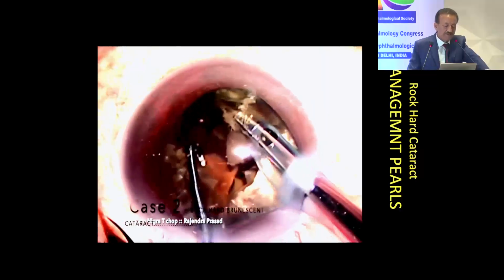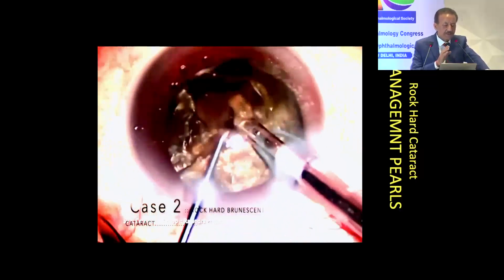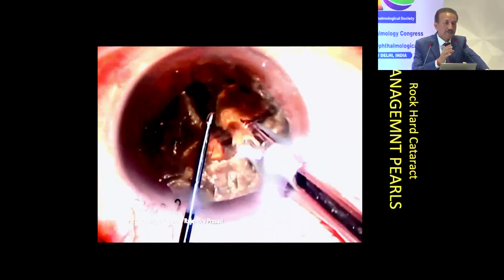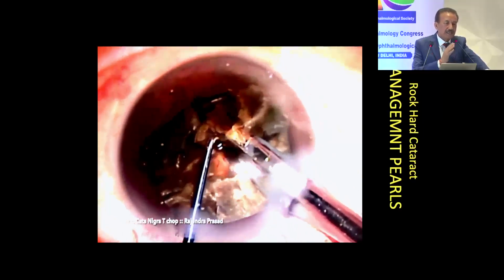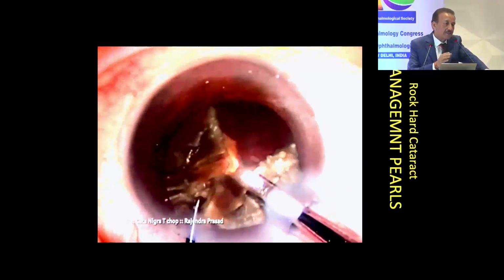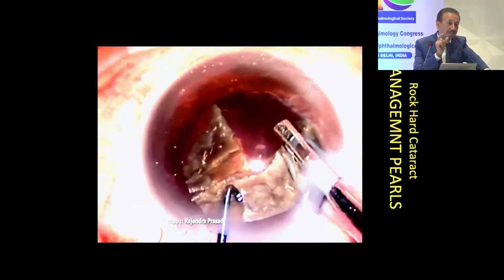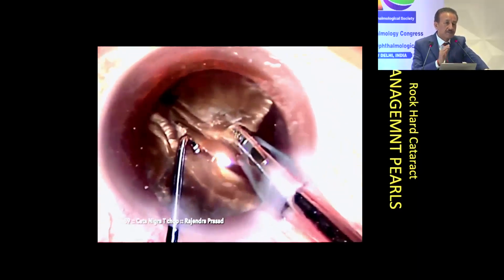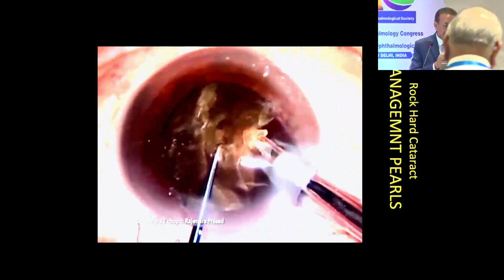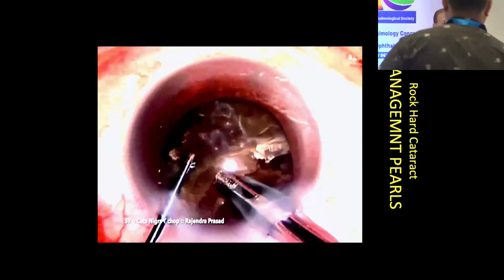Now you are taking the first piece, and see the division of the nucleus, as if you have done a femto division of the nucleus, because you get a sharp cut. It's not a cut actually, it's just a sharp crack. Any hard object, when you crack it, cracks into two completely. This is what is happening with this device. This will happen only with this device because it has an inner wedge, and this wedge actually acts as a cracker, and you can complete the surgery in this kind of cataract.